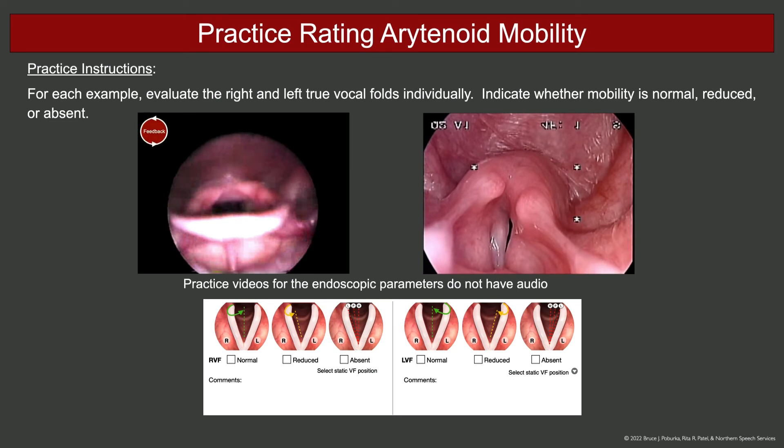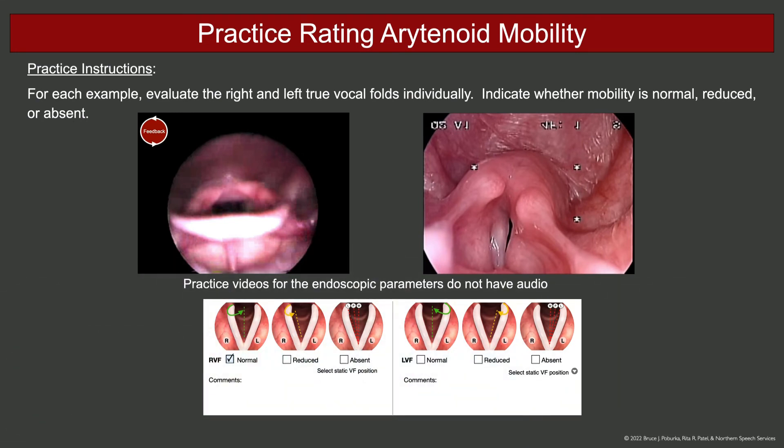In this example, arytenoid mobility is normal on both sides. The rating form should be marked normal for both the right vocal fold and the left vocal fold.